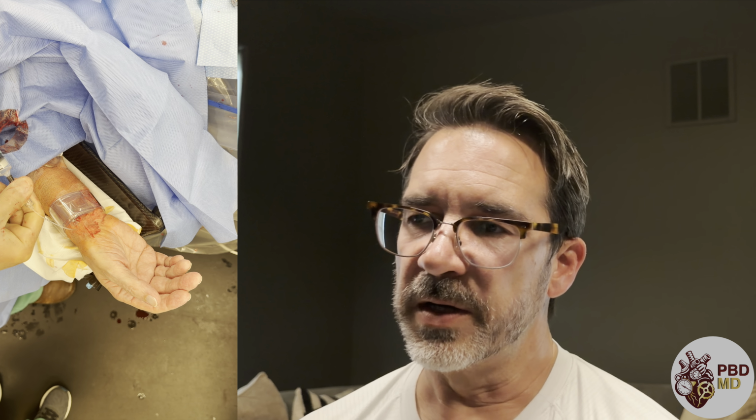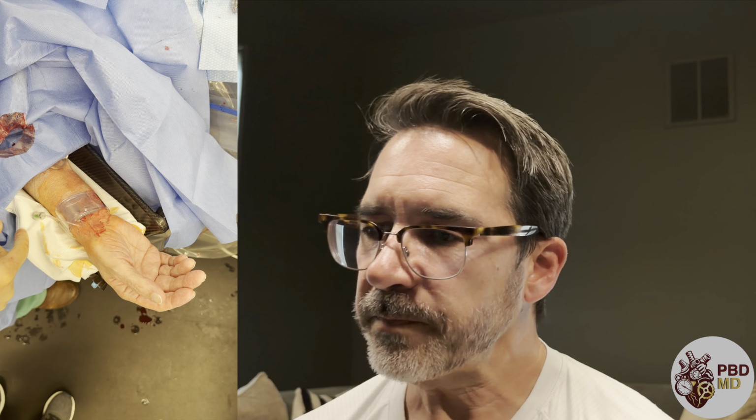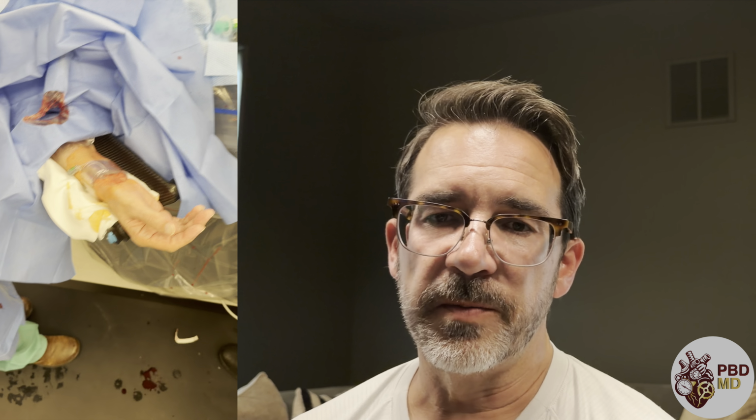And so this technique, putting partial pressure over the artery in conjunction with those medications that I described earlier when we just got started, is going to go a long way to keeping the vessel open. Hopefully fewer than 1 in 20 people are going to have any sort of problem with the radial artery in terms of closure or long-term pain or anything like that. So this was a pretty straightforward left heart cath, or coronary angiogram.